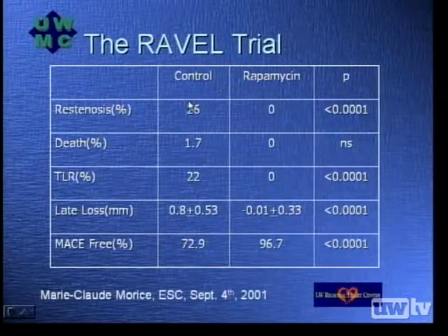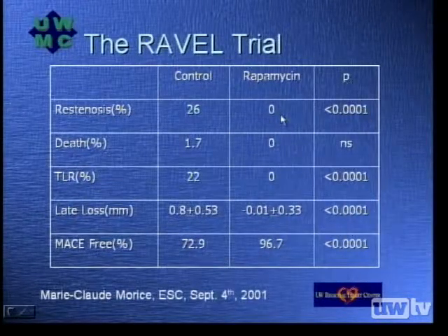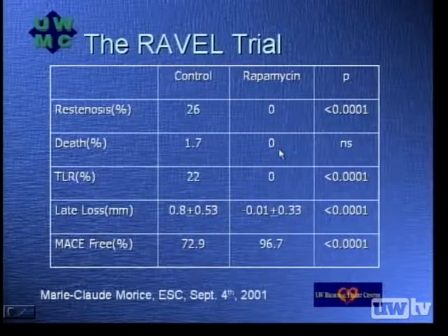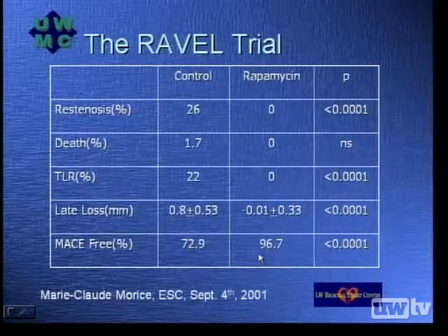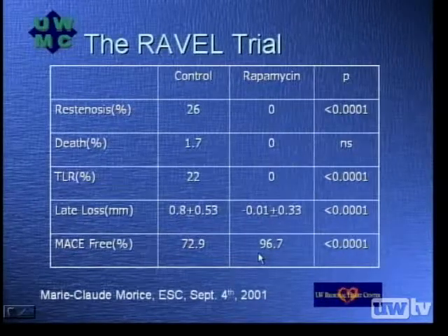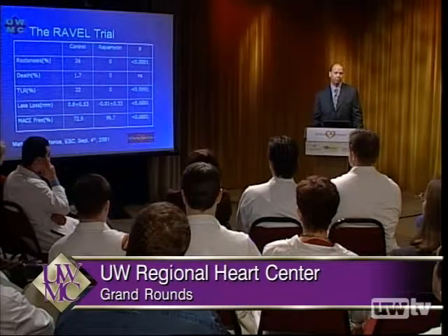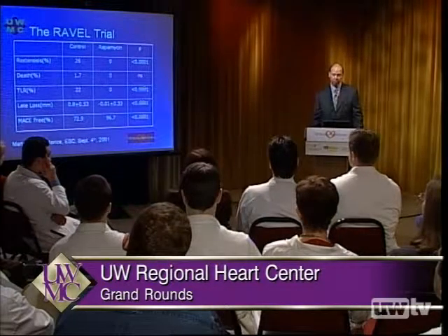So in the control group, those who received regular stents, the restenosis rate angiographically in follow-up was 26%. The restenosis rate with the treated group was zero. There were no deaths in follow-up. And if you look down at major adverse cardiac event-free survival, 97%. These are all obviously highly statistically significant, and this does bring potentially a new mode of treatment for patients with in-stent restenosis, as well as patients undergoing routine coronary angioplasty and stenting as well. But again, I think it's important to point out also that I've never in my career seen anything in medicine that is zero. So I suspect that this rate will increase with more patients, but clearly the impact that this will have on our practice is going to be rather profound, I believe.